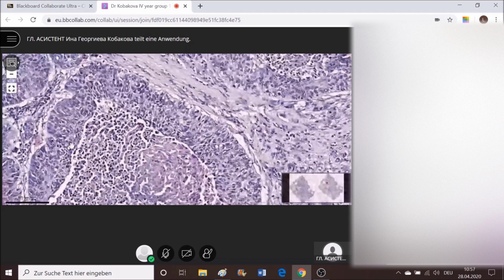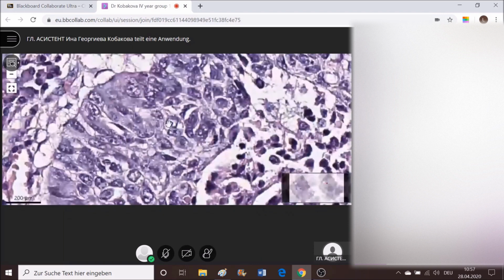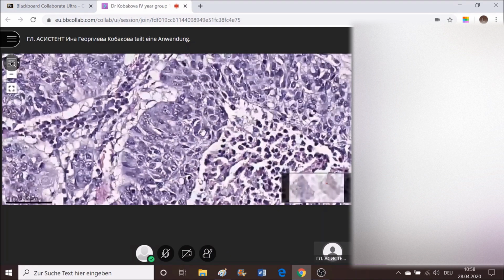And if you take a look at the nuclei themselves, they'll be appearing at some points with a very evident nucleolus. Here, here, also here. At some slides, it might even appear reddish. These are the nucleoli in nuclei with dispersed chromatin in eosinophilic cytoplasm, and they're on multiple layers. What we observe here is the beginning of formation of keratin, which again might be observed here.